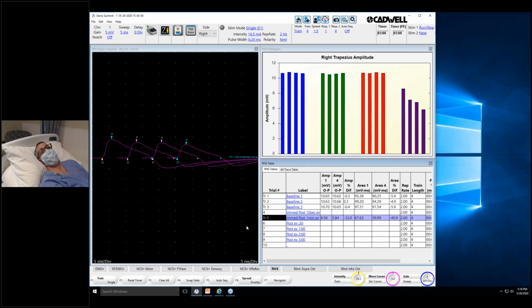And that was the follow-up question: would you do 10 seconds first, followed by 60 seconds, or the opposite, 60 seconds first, followed by 10 seconds? No, I would do 10 seconds first. So I would do 10 seconds and then do 60 seconds after.